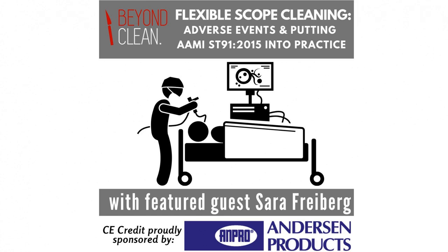I agree that scopes should be inspected throughout every process to ensure patient safety, as well as confirm each scope is in proper working order for the next procedure. Some challenges with borescopes may entail staff being properly trained to detect areas of bioburden or what some potential damage areas may look like. So some hands-on education prior to use is very important. I also believe in thorough, proper cleaning processes for that borescope as well to ensure patient safety.